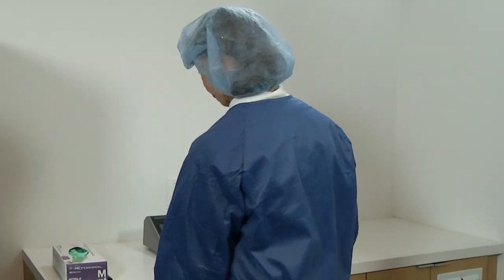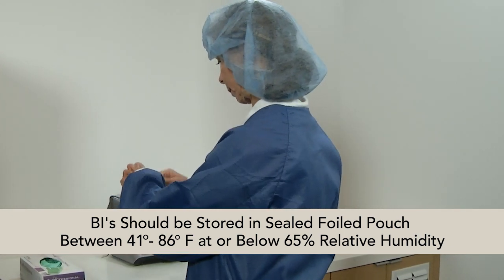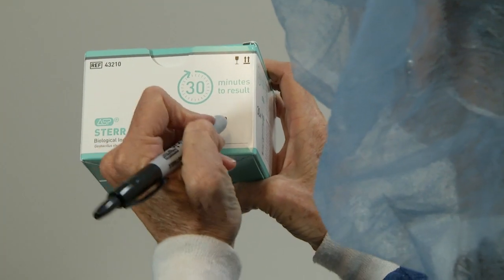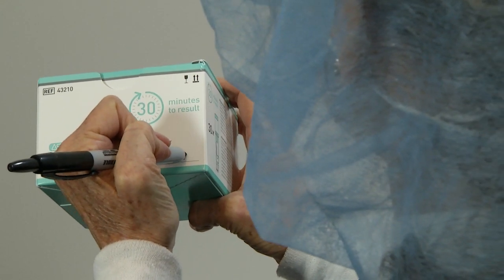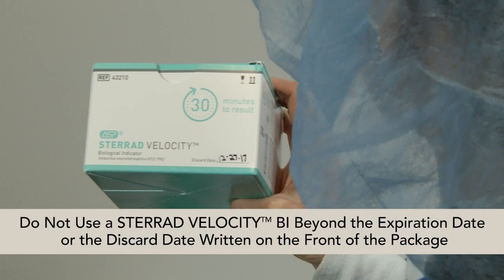To ensure proper storage, BIs should be stored in a sealed, foiled pouch between 41 degrees to 86 degrees Fahrenheit at or below 65% RH. Write the discard date or expiration after opening the foil pouch on the shelf pack when it is first opened. Discard remaining BIs three months after opening the foil pouch. Do not use a STERAD Velocity BI beyond the expiration date printed on the package or the discard date written on the front of the package.